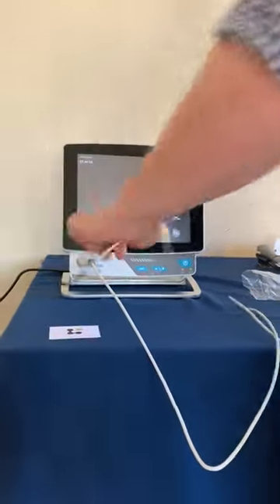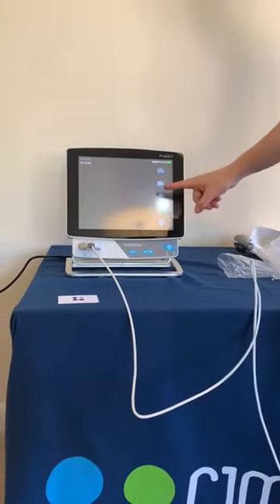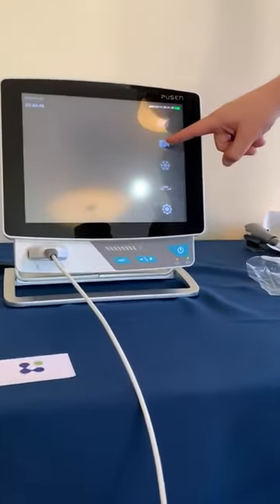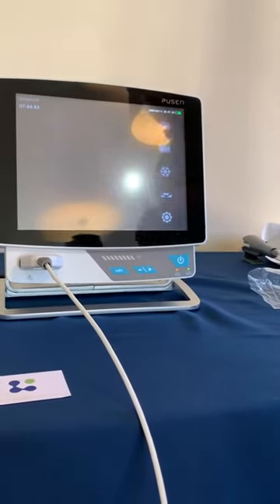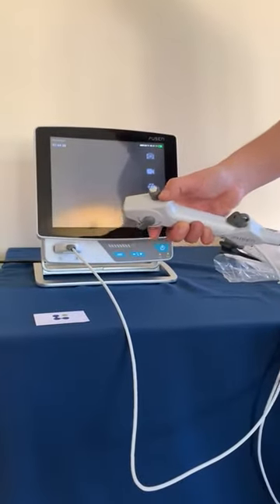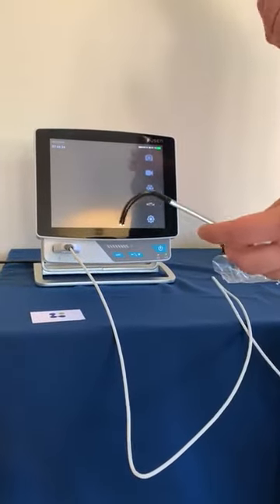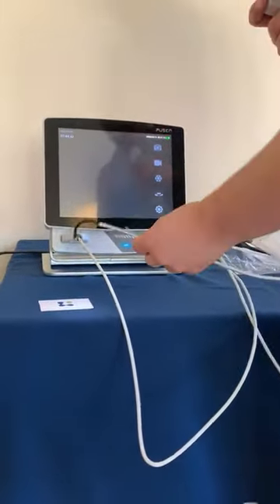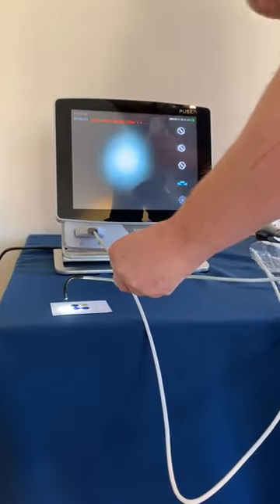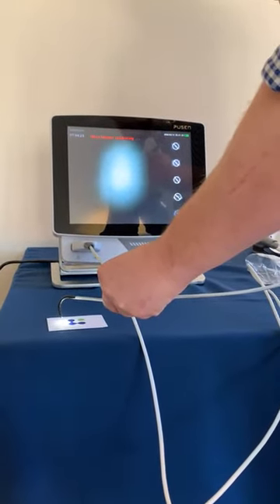Before we do that though, we need to do a white balance. We have the option to either use the touch buttons on the screen — white balance, freeze image, take a video recording or take an image. There is also a button on top of the device which is customisable to allow you to do any one of those items. At the moment, mine is set to do a white balance. So we will take our white surface, press and hold the button, and as you can see on the screen, white balance has started. We'll wait for that to say that it's been successful.